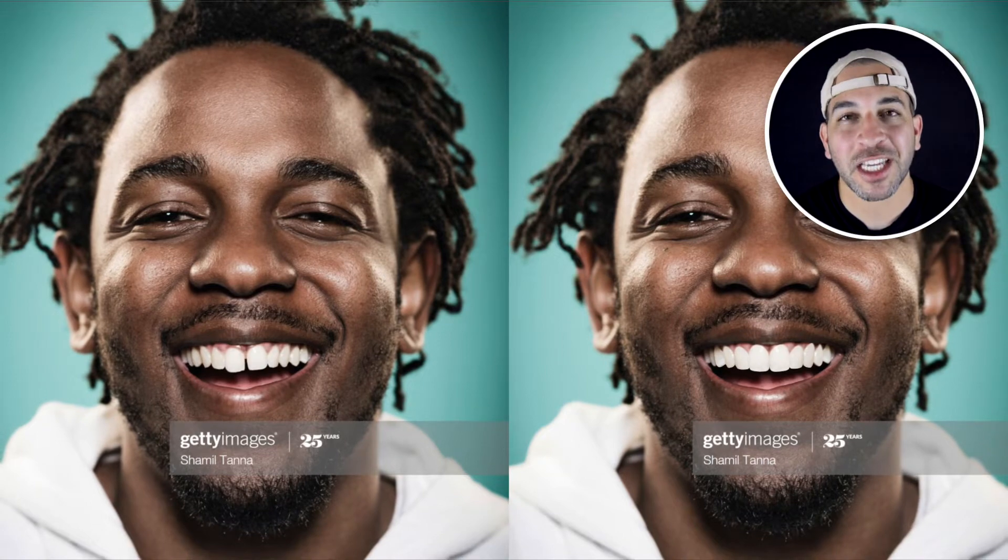Hey, what's up guys? It's Dr. Sammy and today I'm going to show you how I use technology to show my patients what's possible with porcelain veneers.